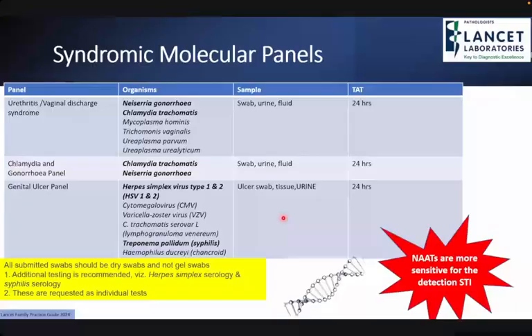And then serology for syphilis is very important as well. Especially with genital ulcer disease, you need serology for syphilis because the PCR is not sensitive unless you have a primary chancre. That's when the PCR sensitivity goes up to 90%. But otherwise in blood, if you are worried about syphilis, sensitivity is very low, so we don't recommend you do PCR for syphilis.